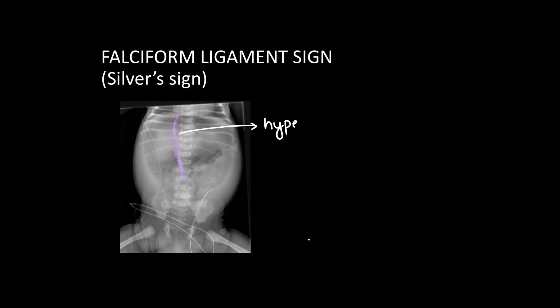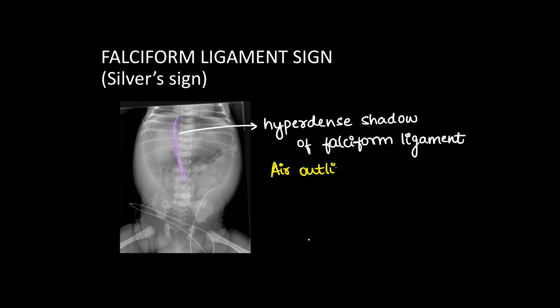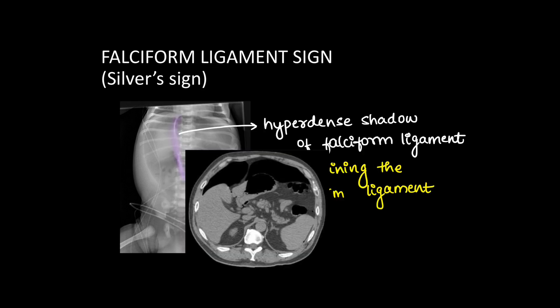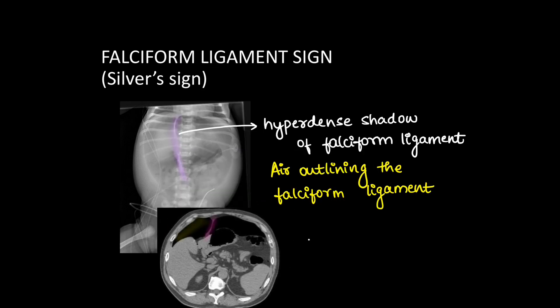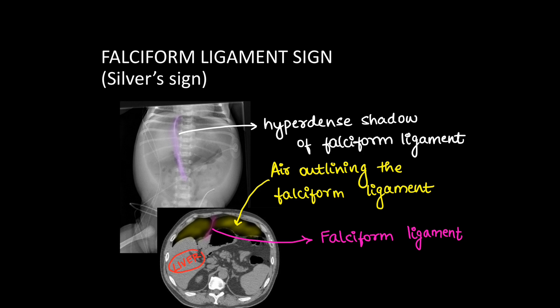Next we have the falciform ligament sign, also known as the silver sign. In this x-ray we can see the hyperdense shadow of the falciform ligament. The falciform ligament attaches the anterior surface of the liver to the anterior abdominal wall, and when air outlines this ligament it is separately seen — surrounded by air on either side and hence very well visualized on the AP x-ray.